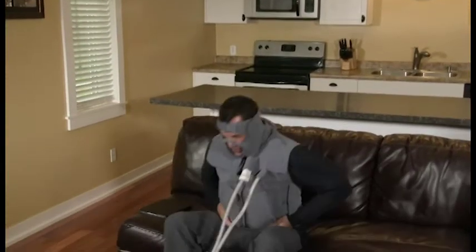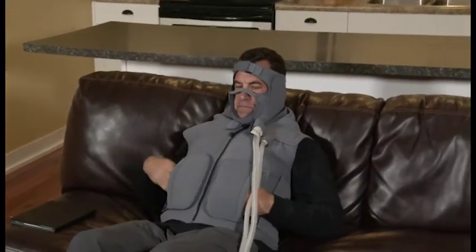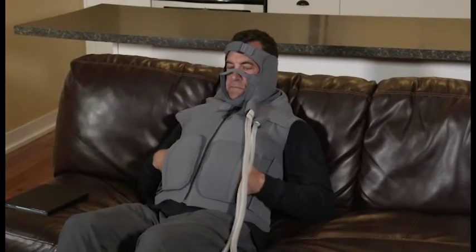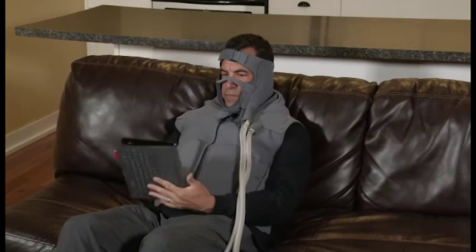For the treatment session, sit in an upright position or recline at approximately a 45 degree angle. Once seated, adjust the garments as needed to maintain a snug and comfortable fit. You are now ready to start your therapy session.